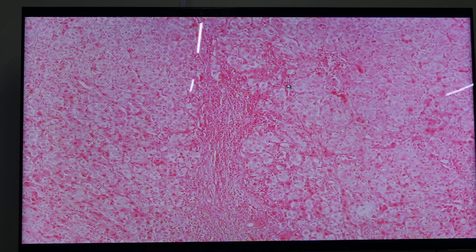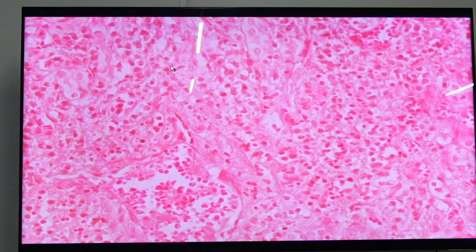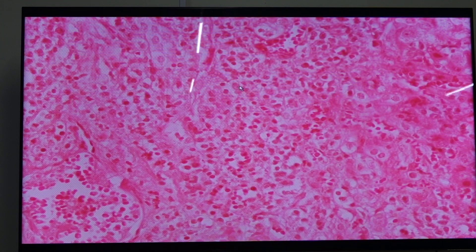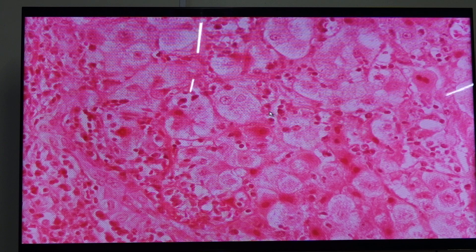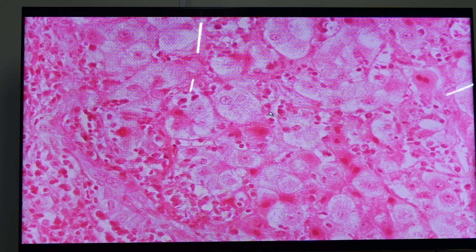Accompanying it is the presence of inflammation. The hallmark or defining feature of chronic hepatitis is the presence of mononuclear cell infiltrates found in the portal tracts. As you can see, they are forming pseudonodular formations — that is why this is chronic aggressive hepatitis — due to the presence of inflammatory cells linking the different portal tracts to one another.